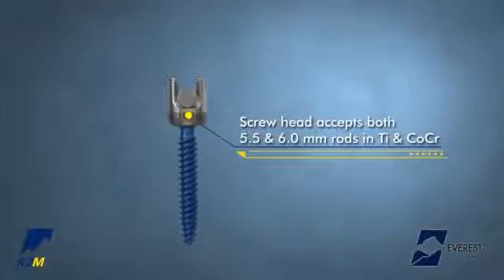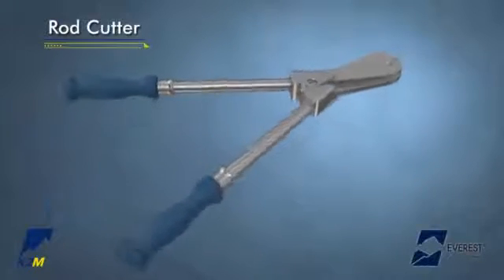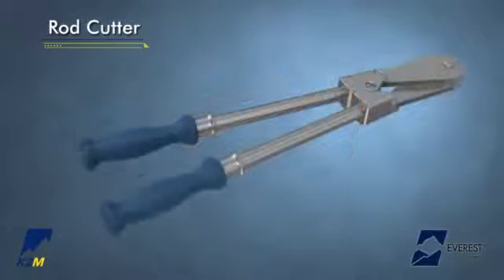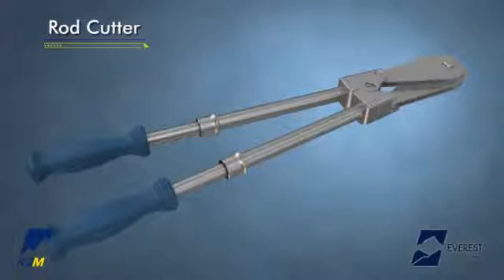If necessary, the rod cutter can be used to cut the rod to the appropriate length as determined by the surgeon. Insert the rod into the end of the rod cutter and squeeze the handles together. To extend the handles, pull the handle engagement toward the cutter head and pull the handle in the opposite direction. Be sure to leave appropriate rod overhang, taking into account compression, distraction, and other manipulations.